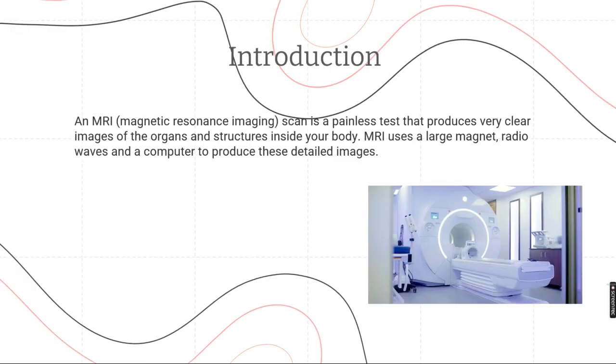Introduction. An MRI or magnetic resonance imaging scan is a painless test that produces very clear images of the organs and structures inside your body. MRI uses a large magnet, radio waves, and a computer to produce these digital images.